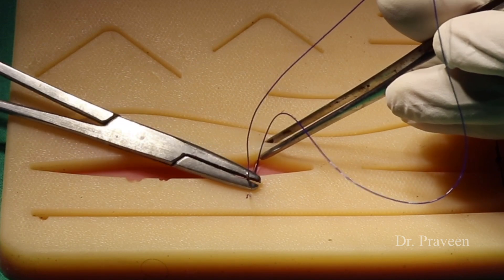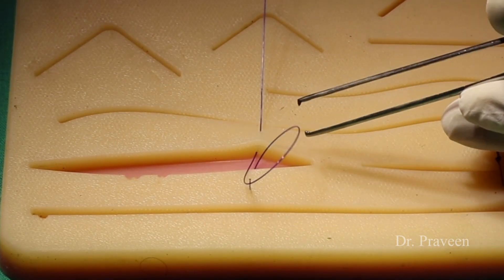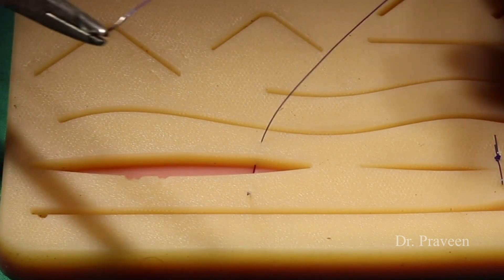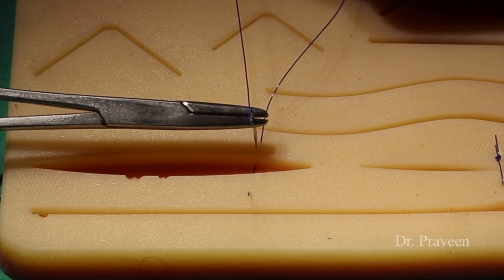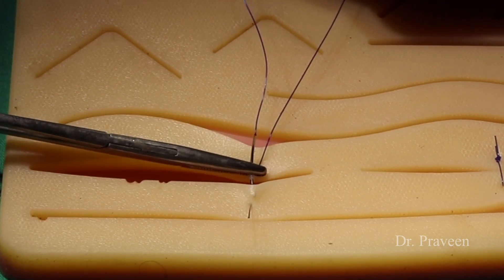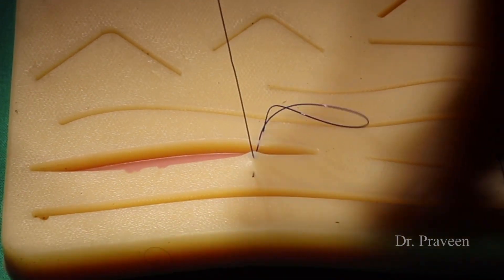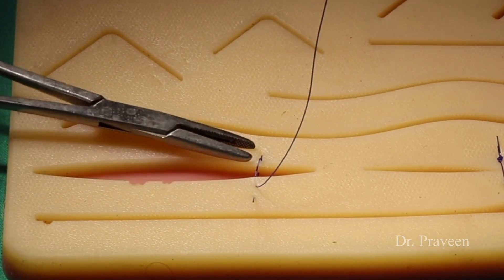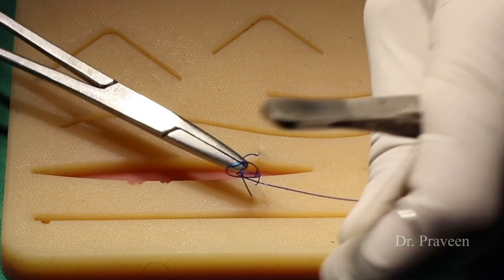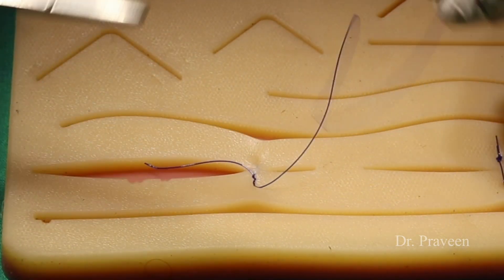The word Gofanika suggests a gulail in which two uneven structures are tied or bonded with a knotting joint. Here we are performing a vertical mattress suture — similar to the simple interrupted suture, with a reversing step to approximate the wound margins. Knot placement is the same as the previous one: surgeon's knot — two loops clockwise and one loop anticlockwise. This is the vertical mattress suture compared with Gofanika.